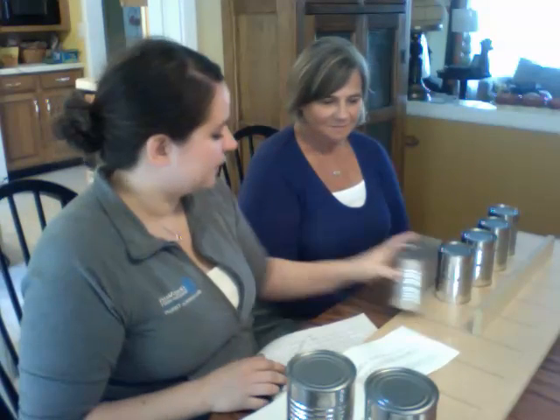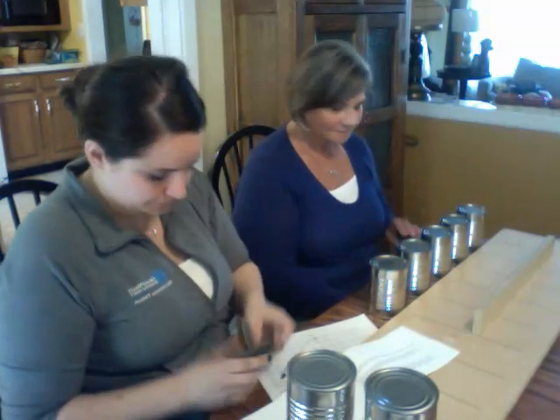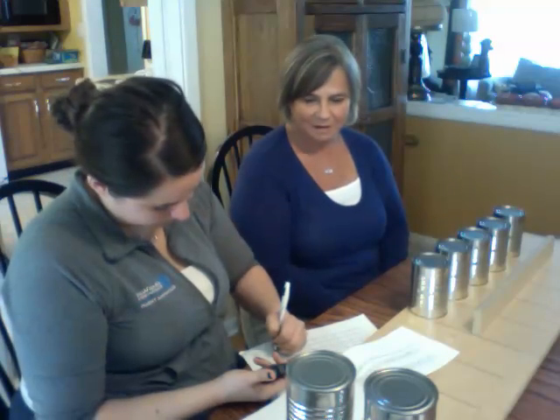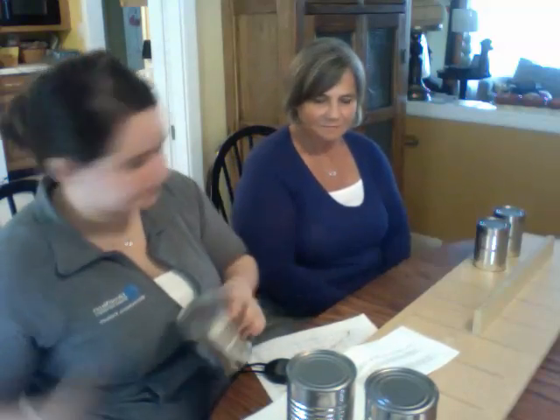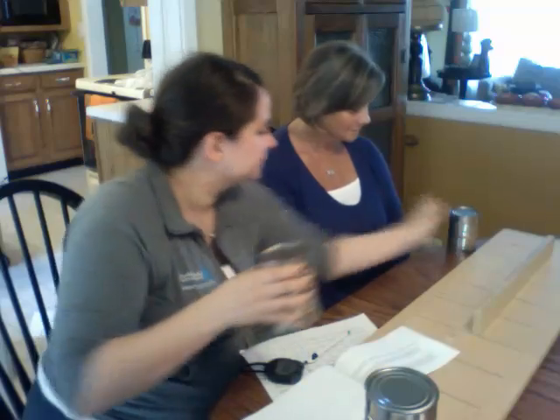All right, we'll do the same thing with your dominant hand, which is your right hand. Starting to put on the table. Ready? Go. Very good. All right, so now we're going to do the same thing, but with heavier cans. And again, nothing is too hard. Everything's okay. It feels all right. Right. All right. Very good.